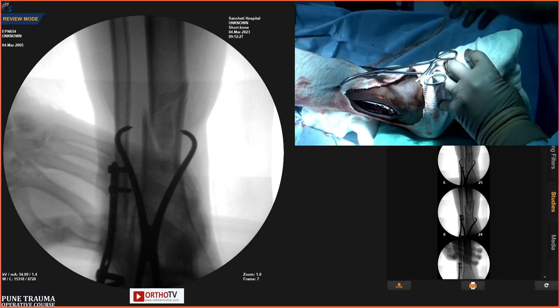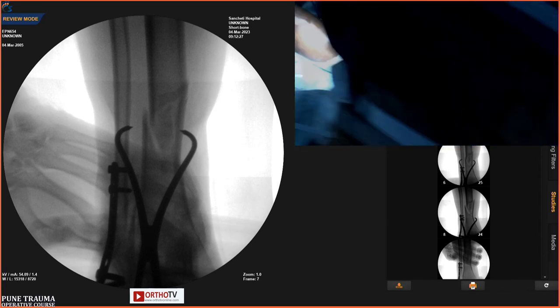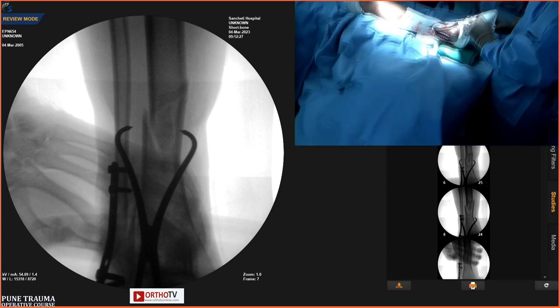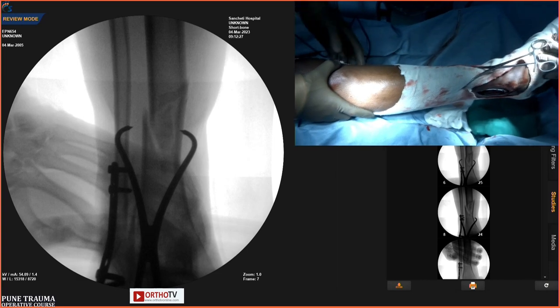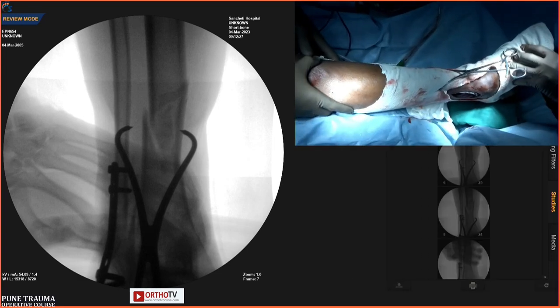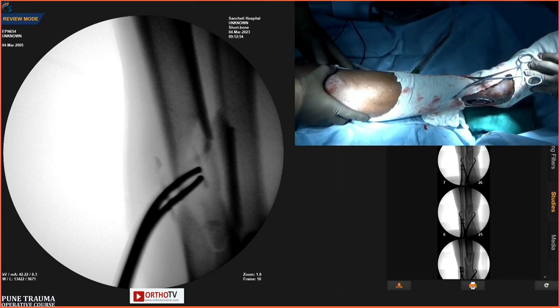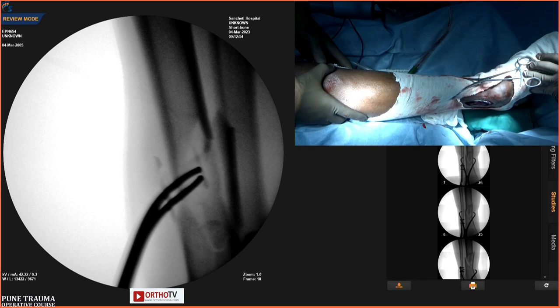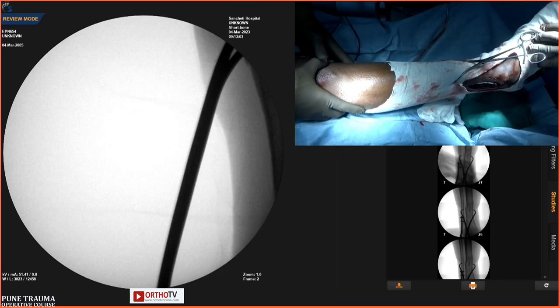And the posterolateral border is the best border to put those plates on. They sit on very nicely. They push the posterolateral fragments anteromedial. So the beauty of the anatomical plate is that if you have a comminuted fibula, you can use it in biological mode, Chetan, when you are starting a spanning fixation. Just take care of your length, rotation and alignment, and then finish your tibial job.